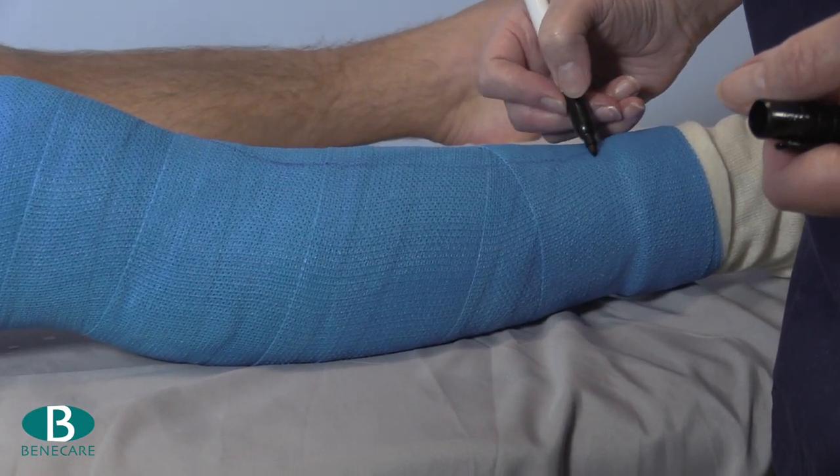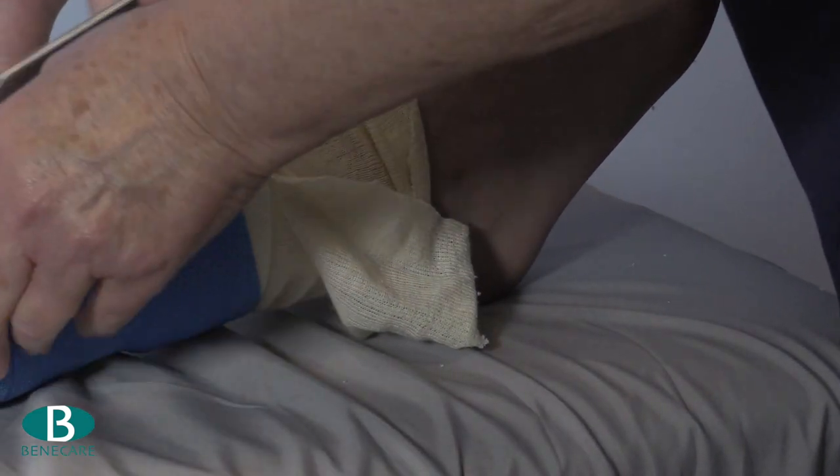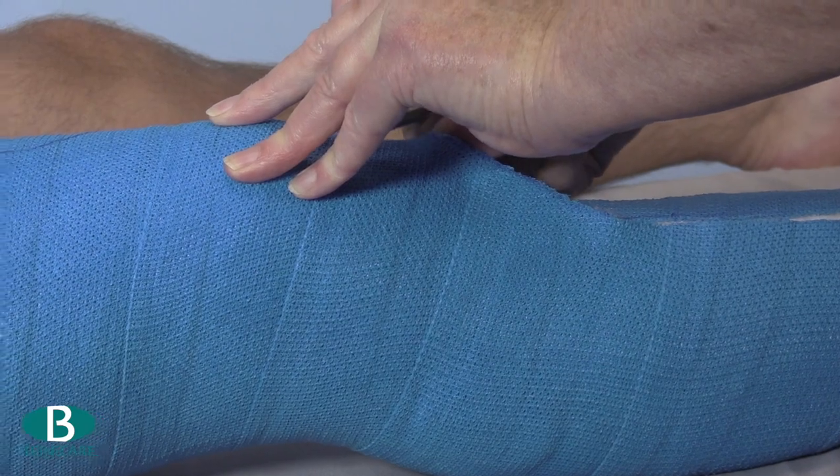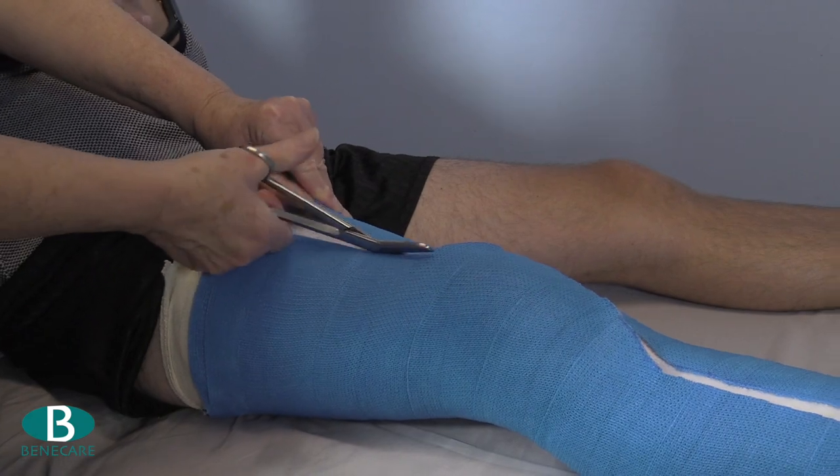The removal mark will need to be a lazy S along the anterior border. Remove the cast using scissors and nibblers, cutting along the template previously drawn, then remove the cast from the limb.